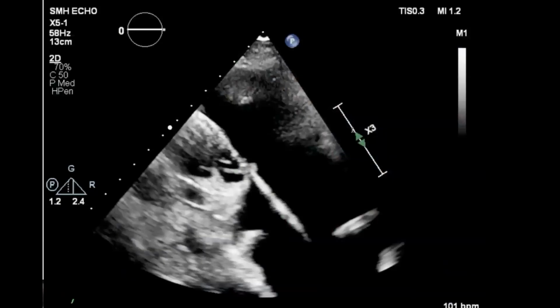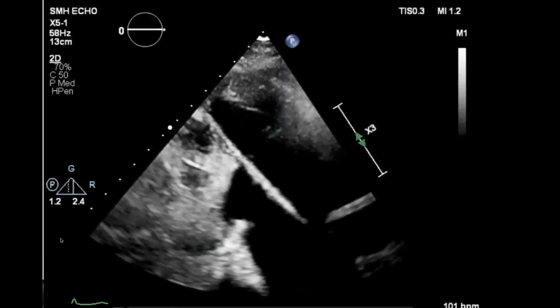So is this possible with transthoracic echo? I'll show you a study here done by one of our sonographers. Shout out Matthew, great job on this study. First of all, I got great views. That's the big limitation. But here you can see. Well, we'll take a look.